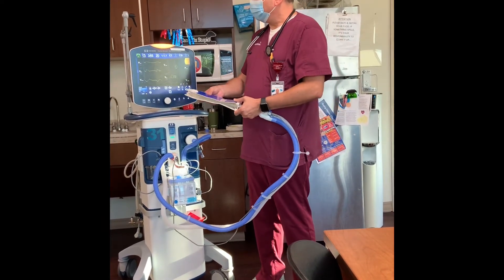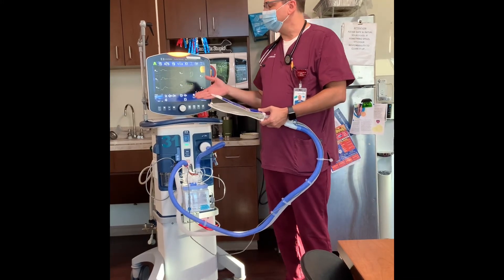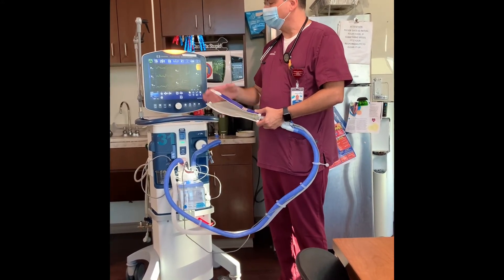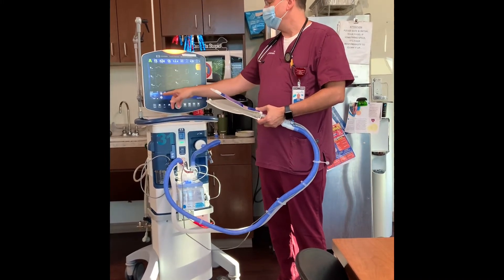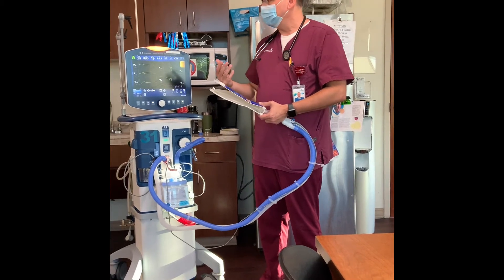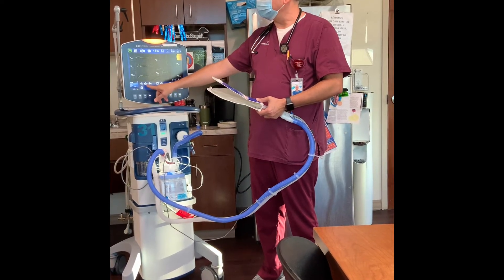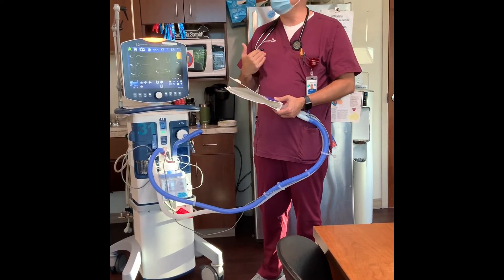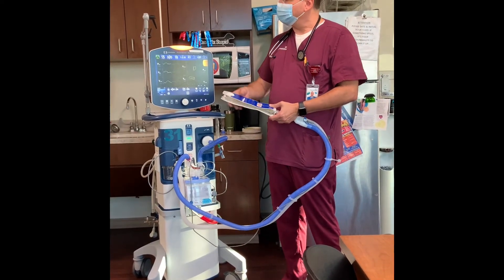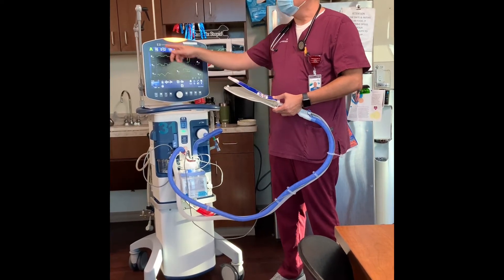The other number to point out on the patient parameter screen is peak pressure — that's how much pressure the ventilator requires to push in that 420 cc's of tidal volume. We have to monitor that because we don't want it to get too high and cause barotrauma. The most common thing that drives up peak pressure is secretions. If there are a lot of secretions, the ventilator requires more pressure to deliver the tidal volume. The easiest way to alleviate that is suctioning. If the pressure gets too high it will pressure-limit and alarm, and suctioning would bring that peak pressure back down.